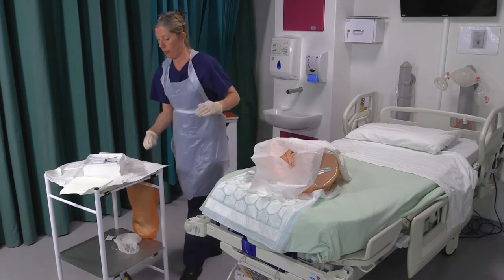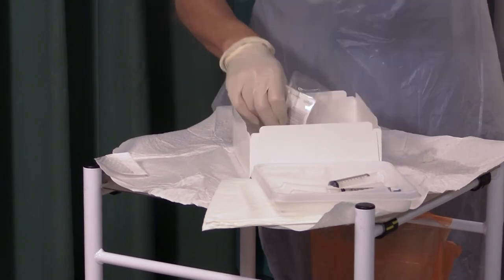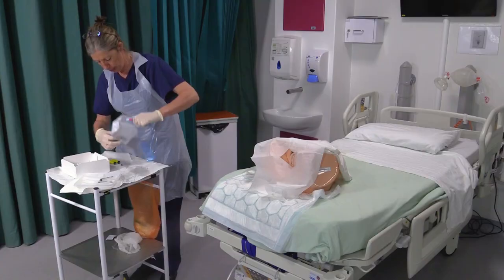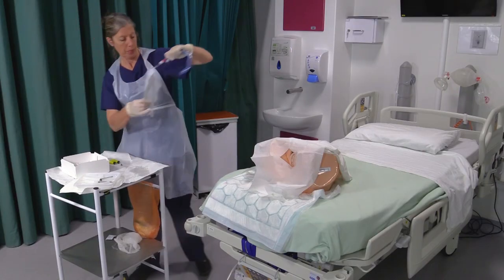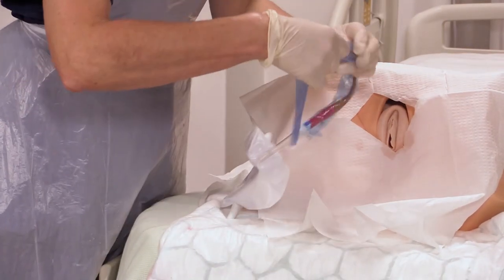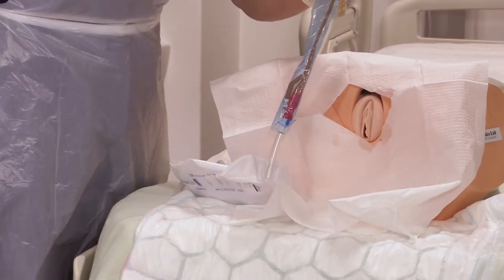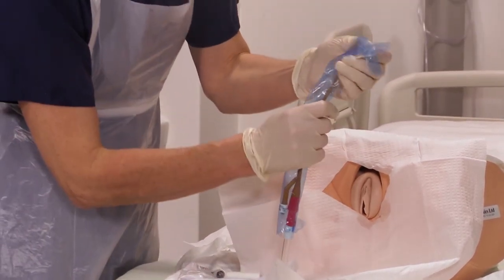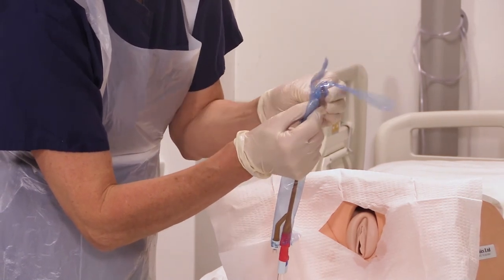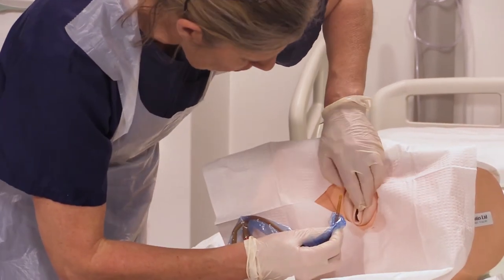And now unwrap your catheter. Tear along the perforated edge of the sterile inner package of the catheter and expose a few centimetres of the catheter. Keep the packaging on to protect the catheter and pull back the packaging as you insert.